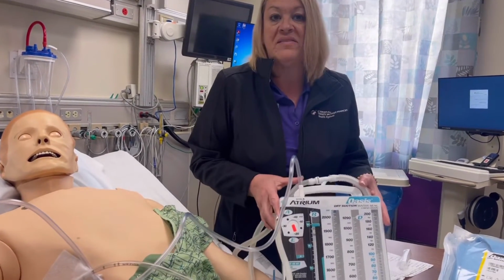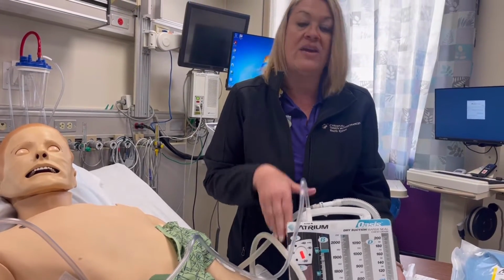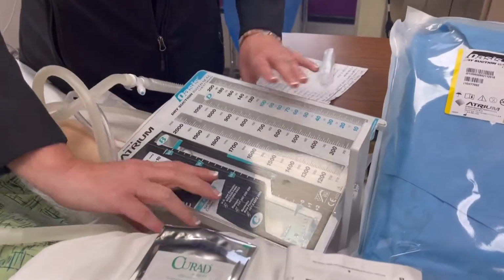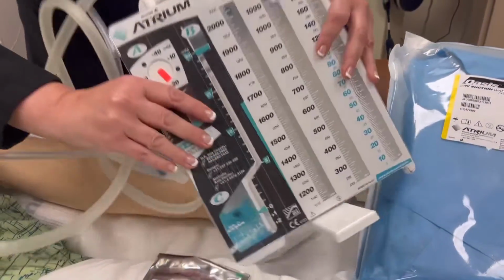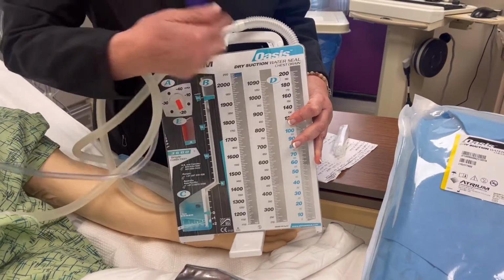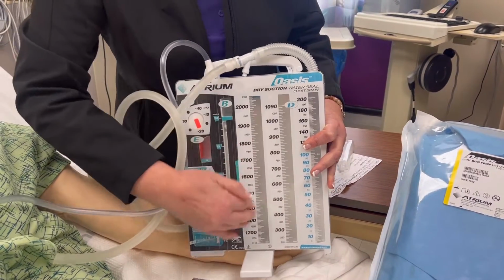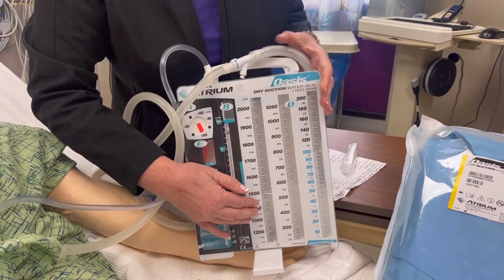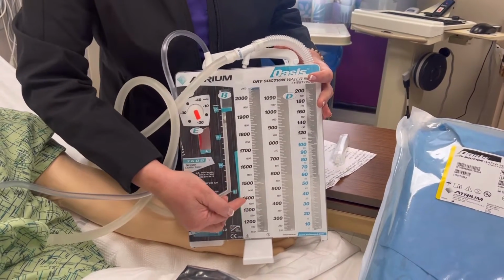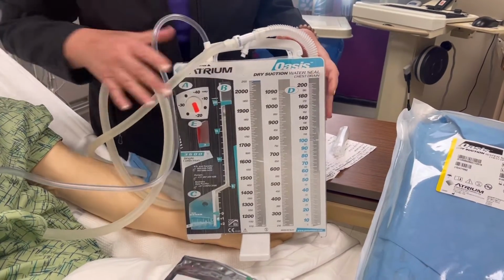So just some quick tips about taking care of your Atrium. What happens if your Atrium falls over? If your Atrium falls over, this is not to be a worry or concern. You merely return it upright, and then you can tip it to get whatever has spilled into the other columns back into the main column. You won't be able to get it all back in there, and that's okay. And then you would mark exactly where it's at so measurement can occur from that point.